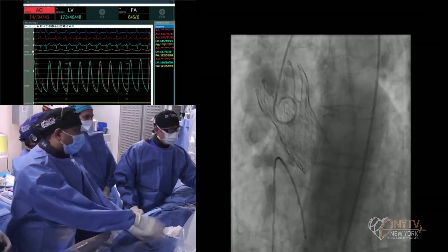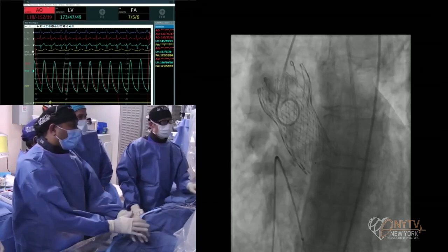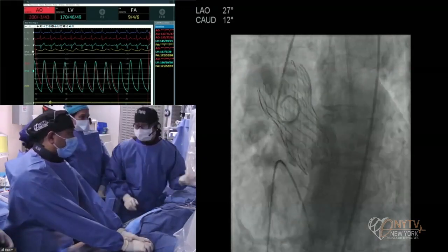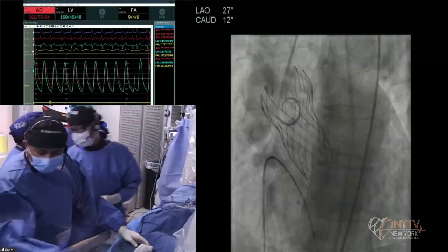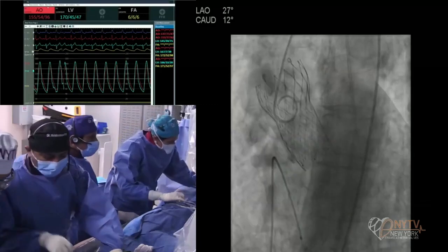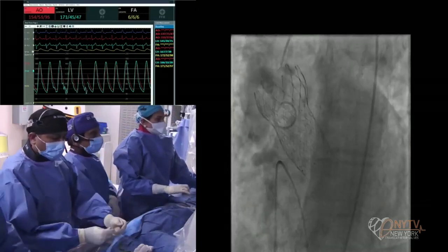It's there. So it's a little bit there. Should we post-dilate? I would post-dilate, because you have good conduction. Let me look: 21 or 22? No, let me know. Now, picture. 21 true. 21 true, okay.